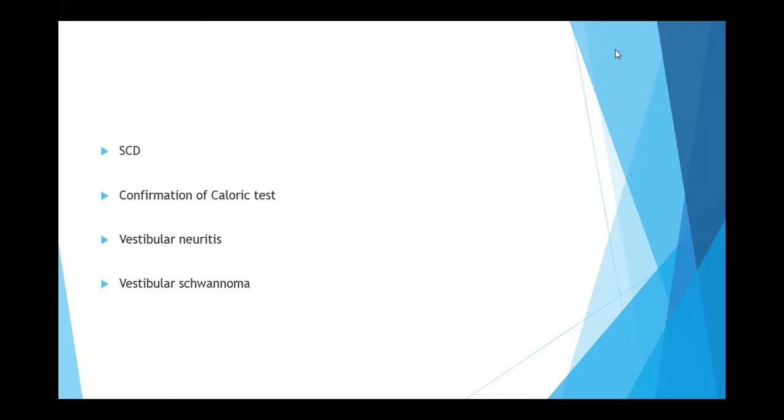When the contraction is made, we don't have any quantification of it. Previously, at least we had the EMG monitor and the rectification. But now, without the monitor and without rectification in the software, we may have asymmetry because of the muscle contraction, which may be diagnosed as pathologic.